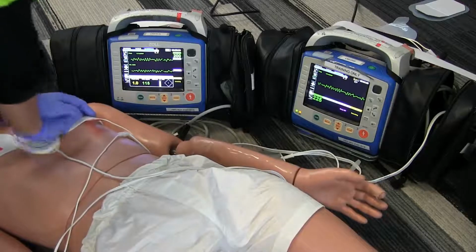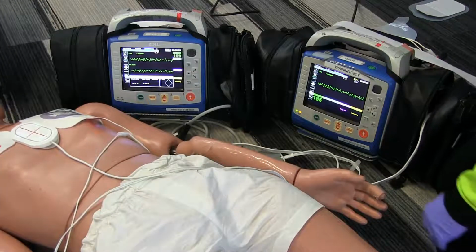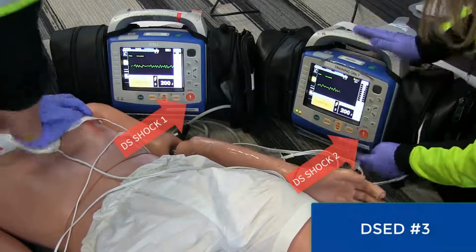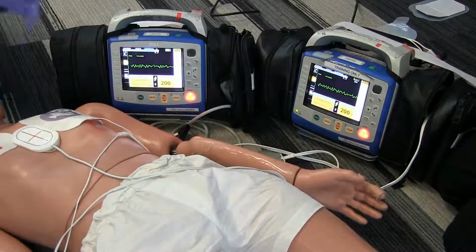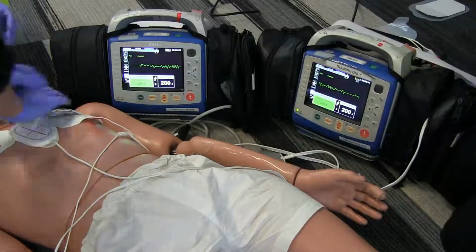One, two, three, four, five, six. Okay, stop CPR. Let's analyze the rhythm. Patient still in VF, continue CPR. Charge for the third double sequential defibrillation. Okay, stop CPR. I'm clear, you're clear, everybody's clear. Shock one, shock two, continue CPR.